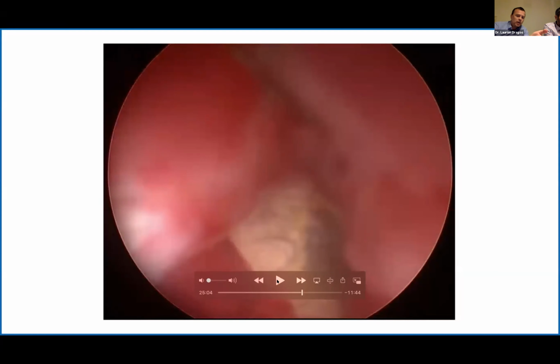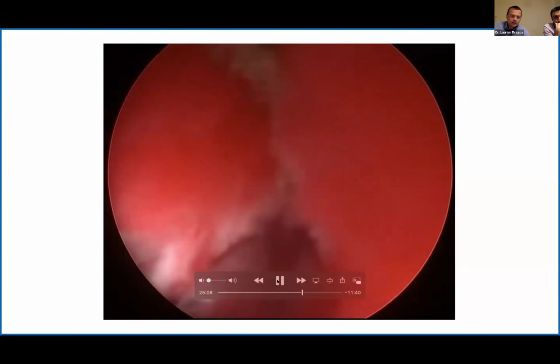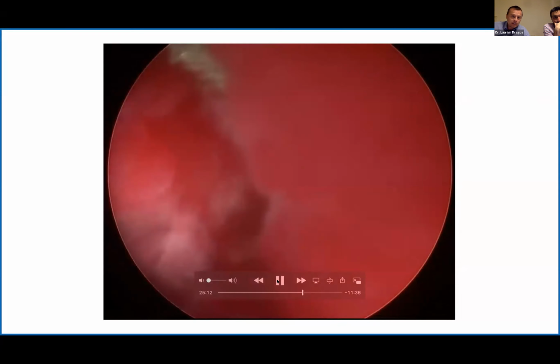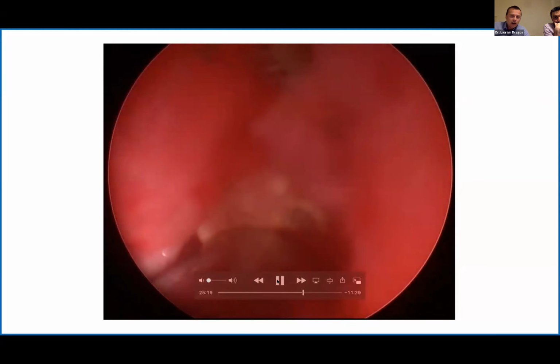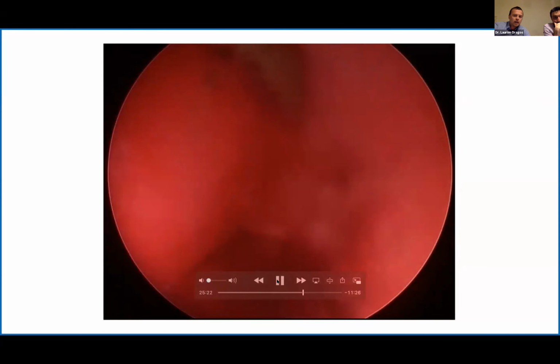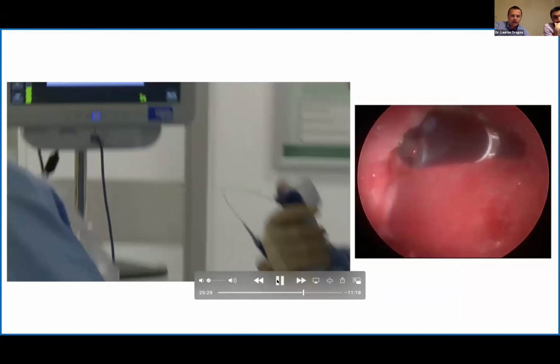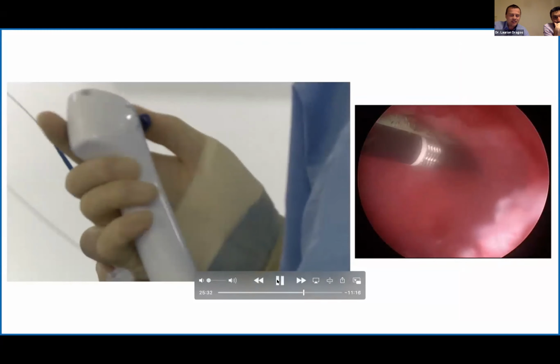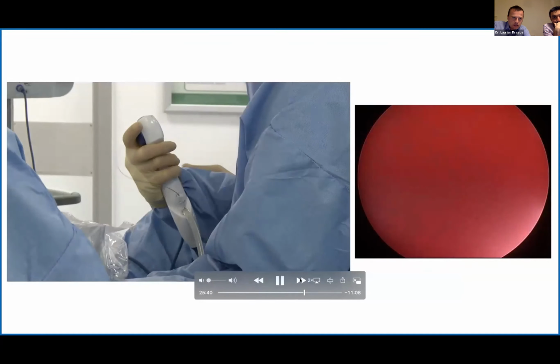Again, I think we are spoiled. We are using these very good single-use flexible scopes, but my instinct was to protect the scope and to prevent damage. As soon as Kasra started to work with his probe, I was always going back below the PUJ, trying to protect it, which at some point I realized is not really necessary. I'm going to throw it away anyway at the end of the procedure. However, you see, it's pushing and pushing and going down to the PUJ. So I decided to help in the end, and I pushed the stone back into the PUJ, and he sorted it out from there.